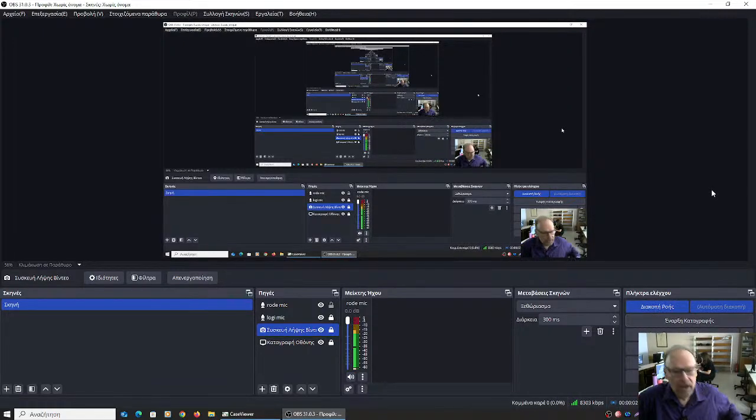Hello, everybody. We are here to study some virtual slides I've selected from Pathology 1 laboratory exercises, numbers 4 to 8. So where would you like to start from? Shall we start from an easy chapter? We'll start from the skin then, okay? Yes. Okay, we'll start from the skin.